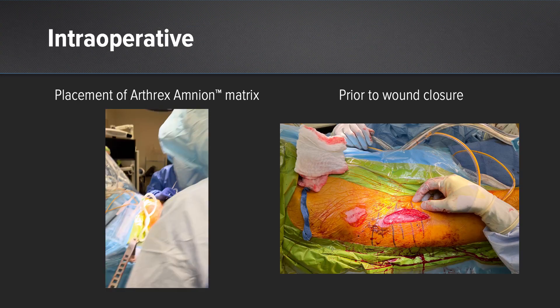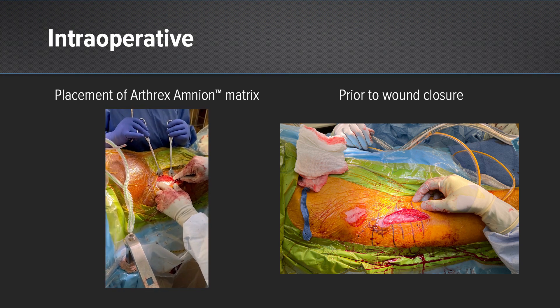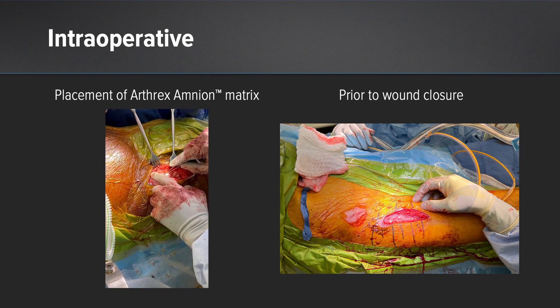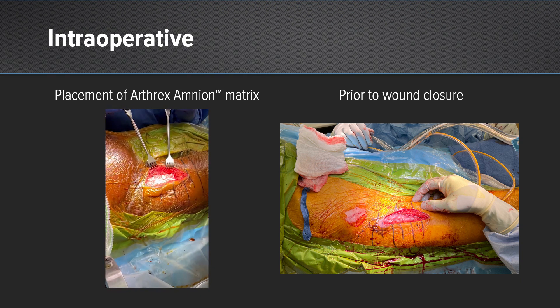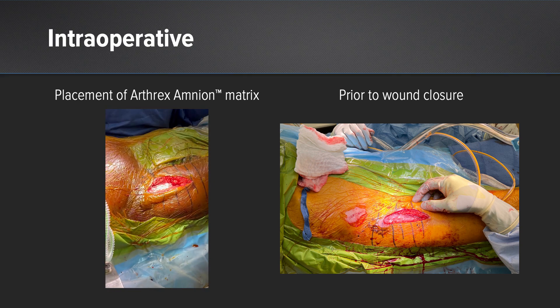As you can see in the video on the left side, this is a video of us placing the amnion. We have performed the hip replacement and closed the tensor fascia. We are placing the amnion product above the fascia and below the subcutaneous fat. We will then close the subcutaneous fat over it and then close the skin as well. On the right side, you can see a photo after we've placed the amnion product above the fascia and below the subcutaneous fat.